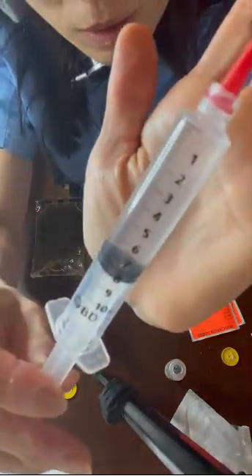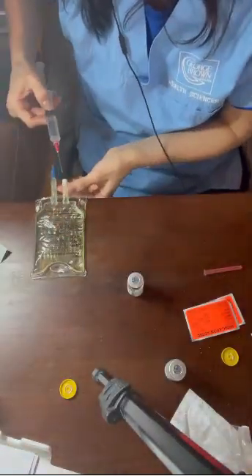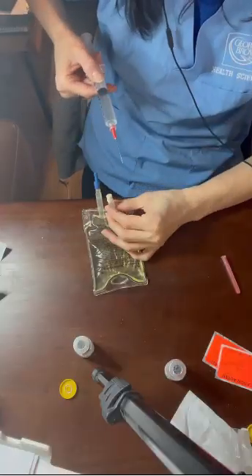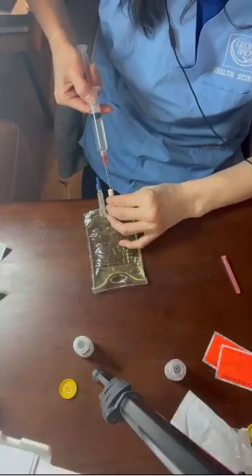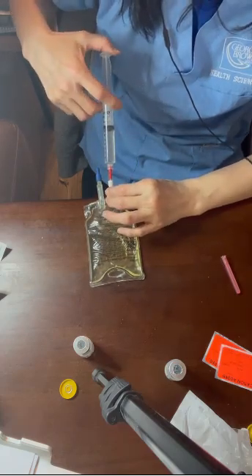And it is exactly 7.5 milliliter. Mix with some normal saline. Don't touch the ports, and then inject this 7.5 milliliters of the pantoprazole.